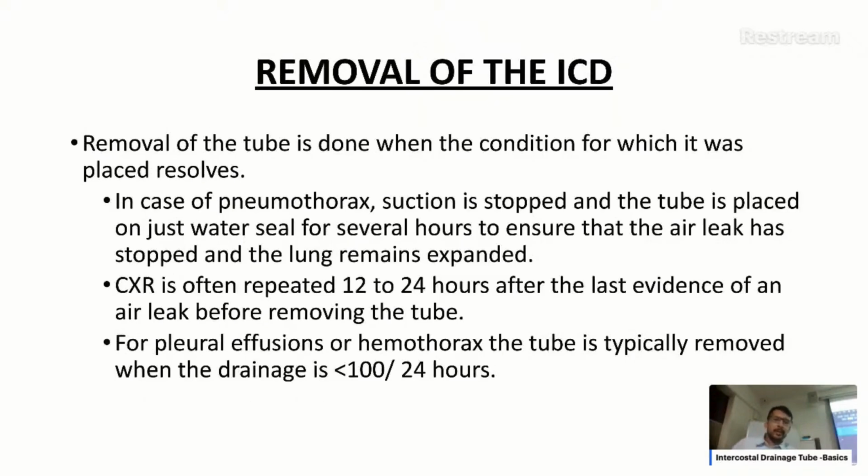So we have talked about the insertion of ICD, but now when to remove? Removal of ICD must be done when the condition why it was placed resolves. In case of pneumothorax, suction is stopped and the tube is placed on just the water seal for several hours to ensure that the air leak has stopped and the lung remains expanded.